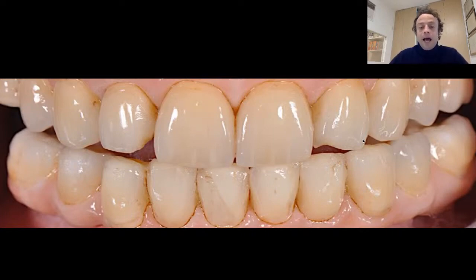And at the same time, we know it's not recommended to remove these prostheses from the mouth, send them back to the lab and ask the dental technician to layer some feldspathic porcelain again.